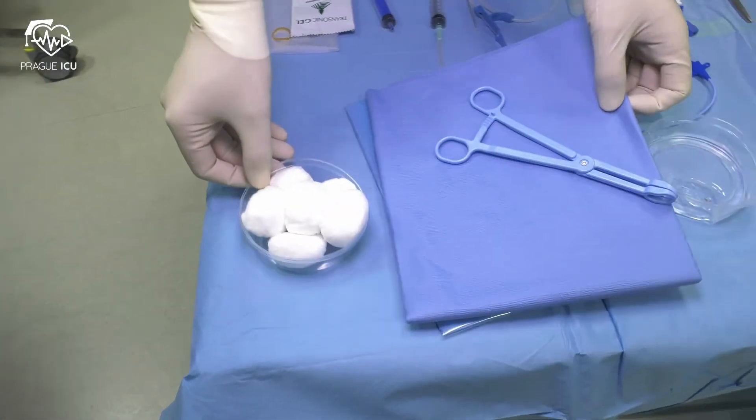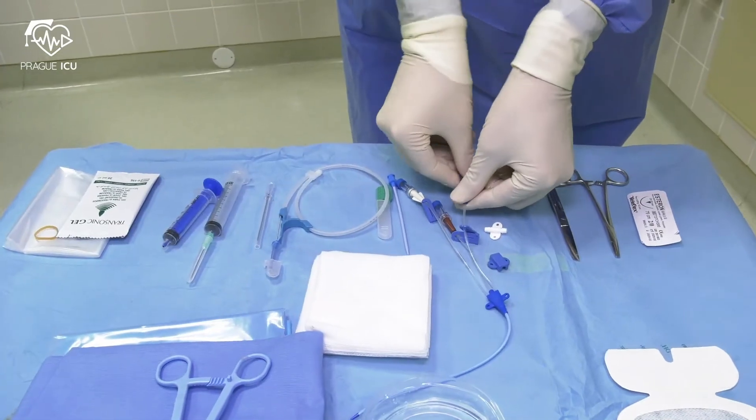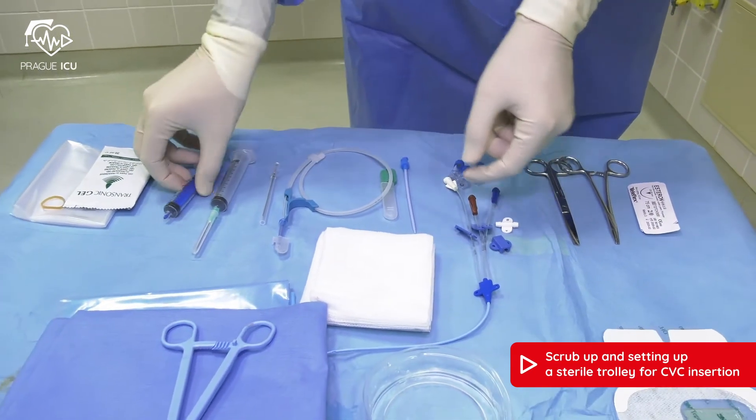Now we prepare the antiseptic solution. Put it directly on the cotton buds. Flush the lumens of the center line with saline.